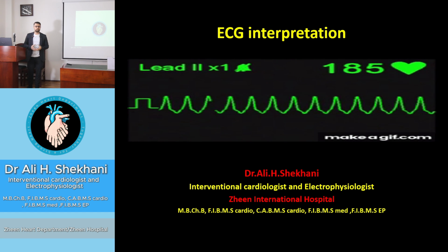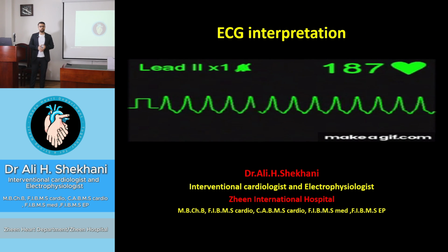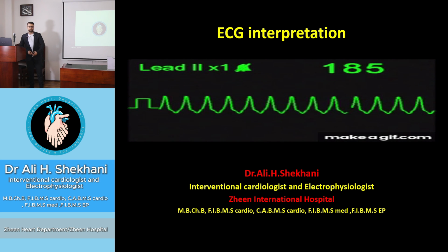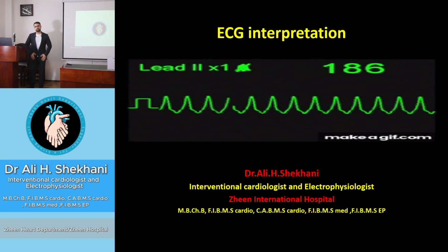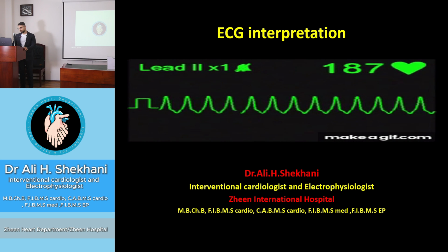You know, the ECG is a very broad subject, so I wanted to simplify as much as possible today, and I highlighted only practical points in the ECG interpretation. I hope you enjoy the session. ECG is a simple and very informative tool for diagnosing frequent diseases. So let me start with the session.